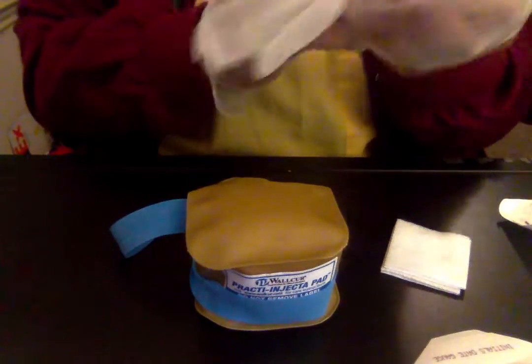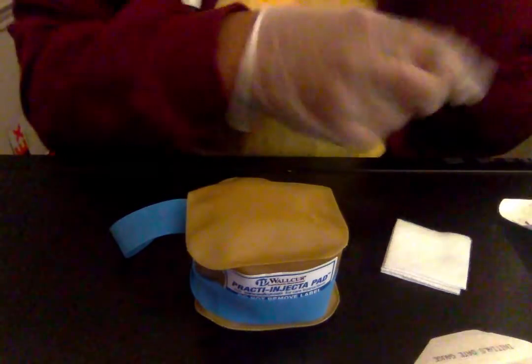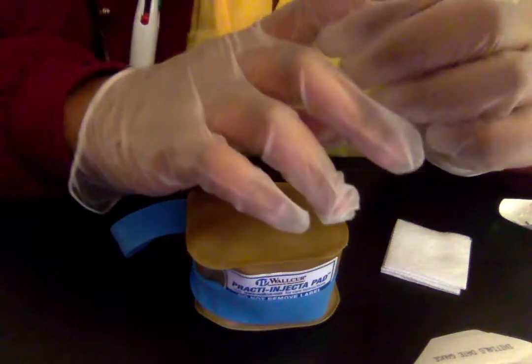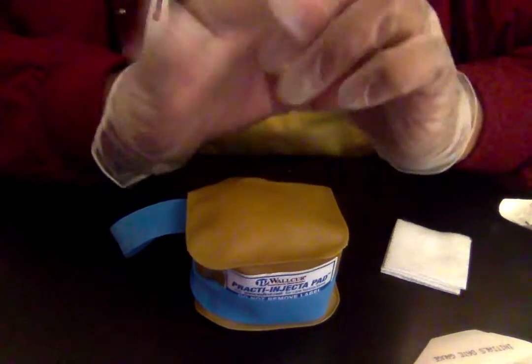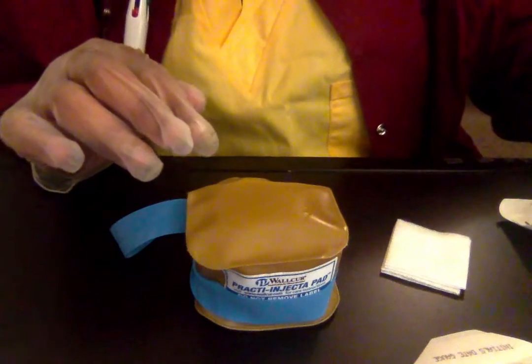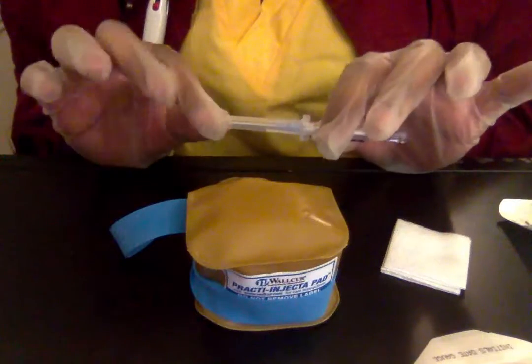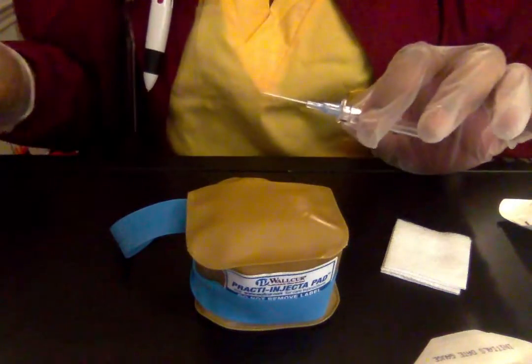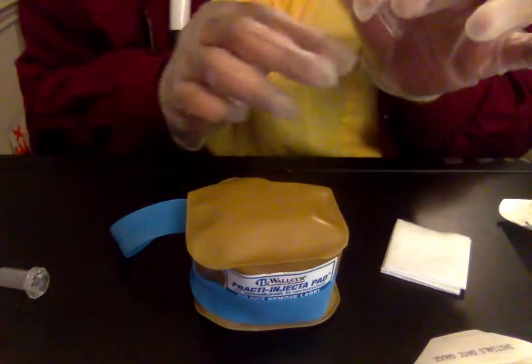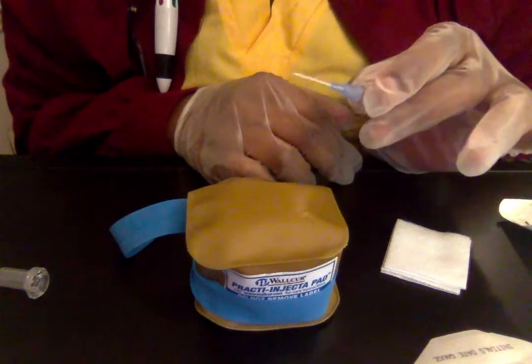Okay, and now my gloves are on. Before doing this, one more time, I want to check my MAR and make sure I have everything. Now that I've made sure I have the right patient and those 7 rights, I'm going to take the top off my catheter for my IV. Make sure my bevel is up. We do want the bevel to be up when we're doing this.